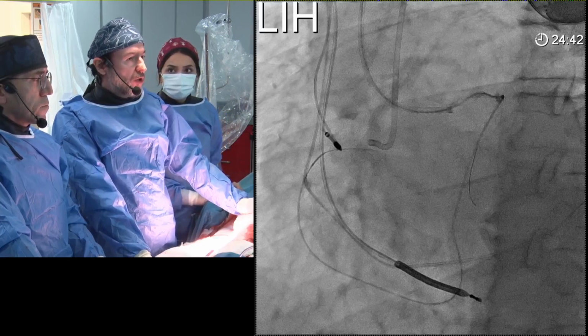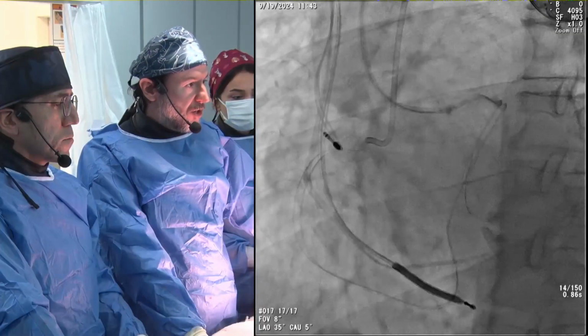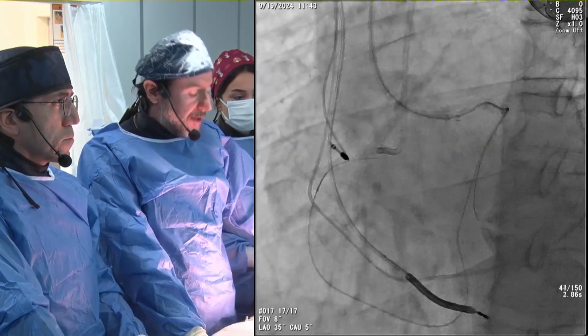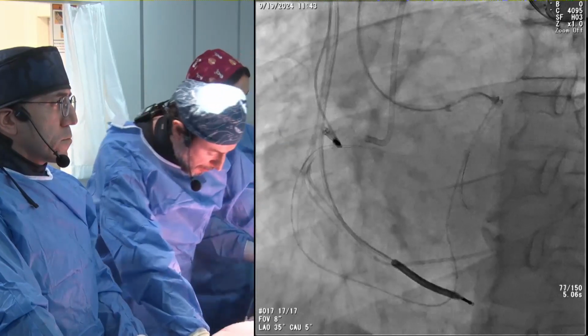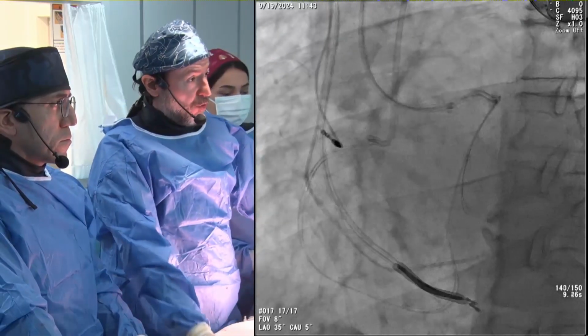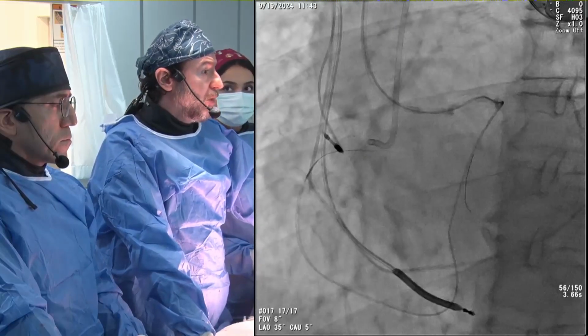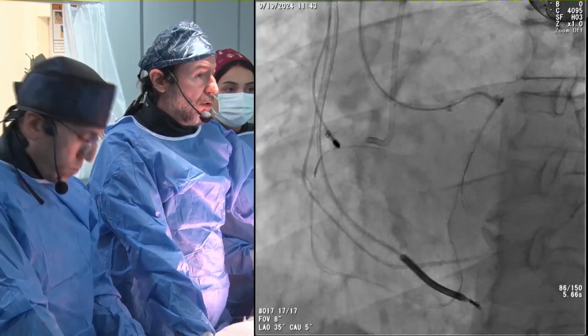Maybe I will go with the wire into the femoral artery and make a very clean puncture. After 30 minutes, I try here retrogradely. And regarding the Carlino, the patient had oral anticoagulation yesterday. That's another concern for me, so it limits my options, actually. I like doing Carlino, but it's also in my mind.